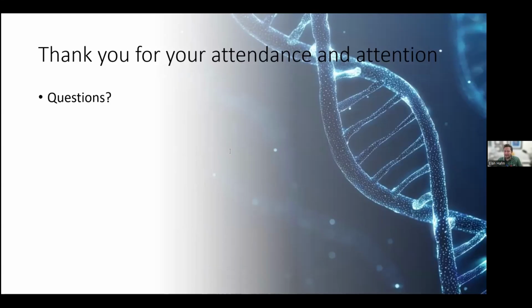So I know MSK, due to their IMPACT study, which sequences tumor-normal pairs, put out a guideline for specific gene types which are more likely to be germline rather than somatic, and variant allele frequency cutoffs, I think 30 or 35% maybe. But it's hard to say. You could get loss of heterozygosity or copy number changes that could impact these things as well.